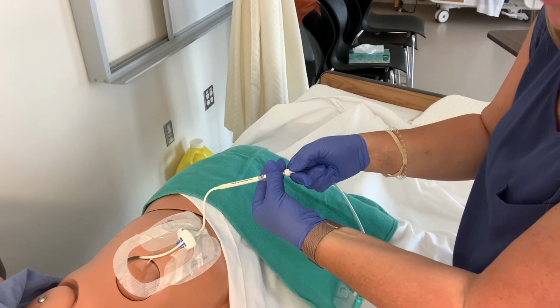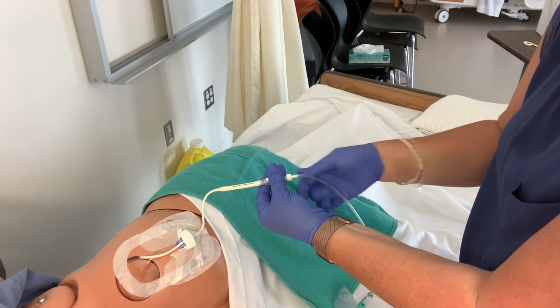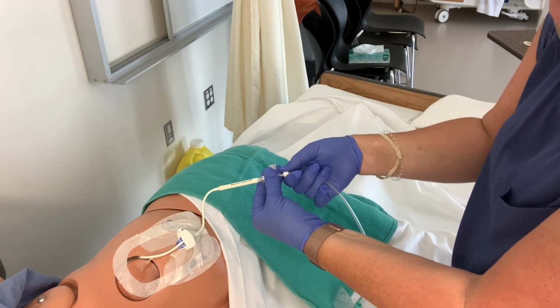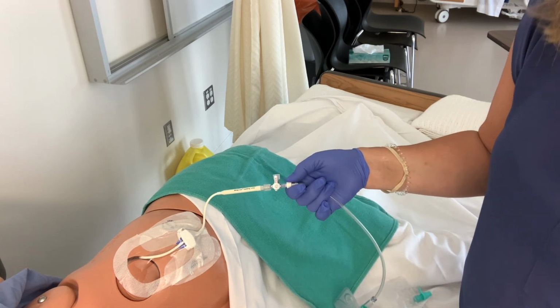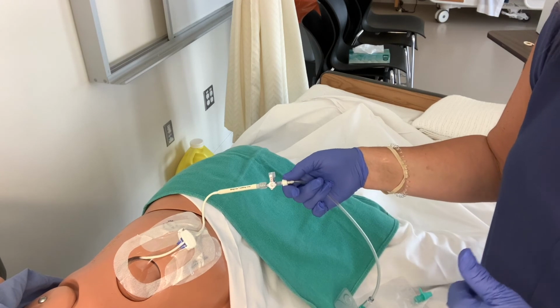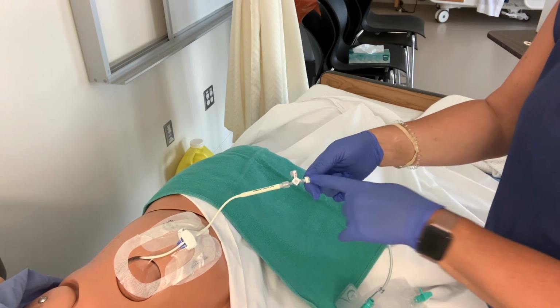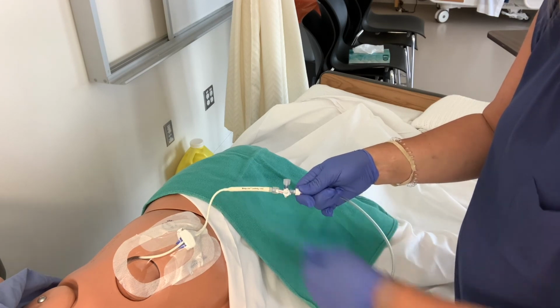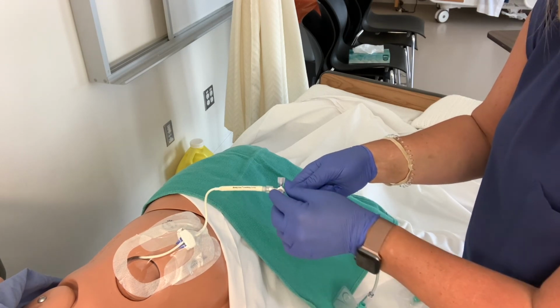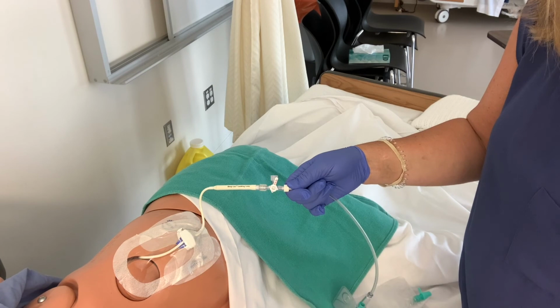So leave that one on and just ignore the new one that came, and always hang on to your stopcock and make sure that it's on or off. We'll be with you, because it's a lot of patting your head, rubbing your tummy kind of thing. It's a little confusing at first, but it's quite a simple process once you get going with it, okay? Hopefully you can see the stopcock there good enough.